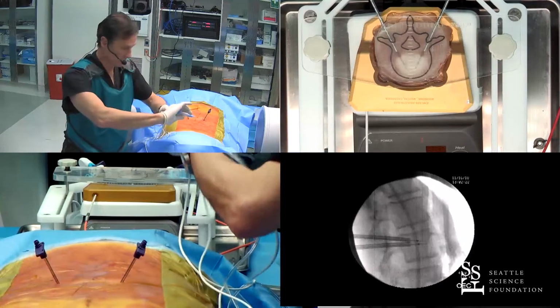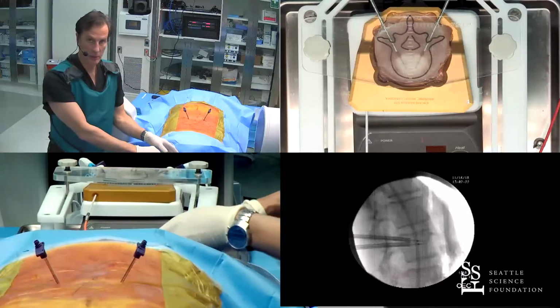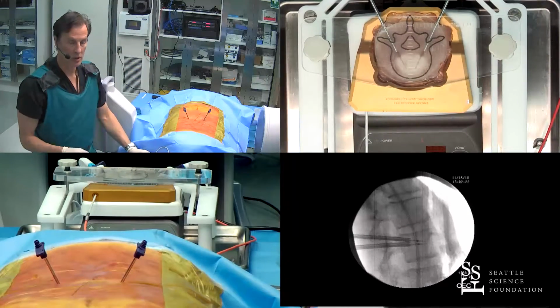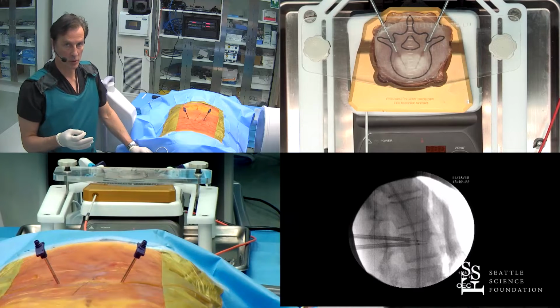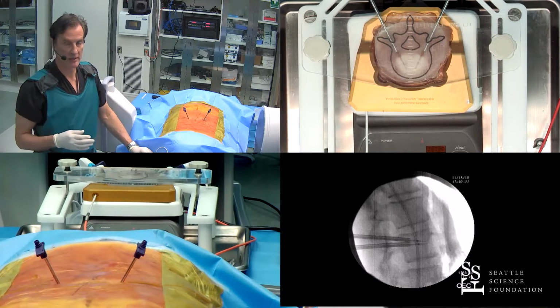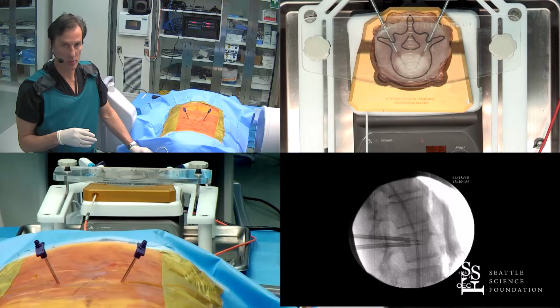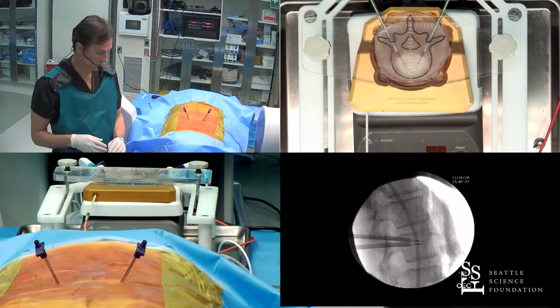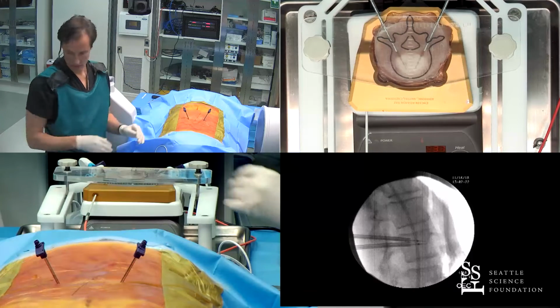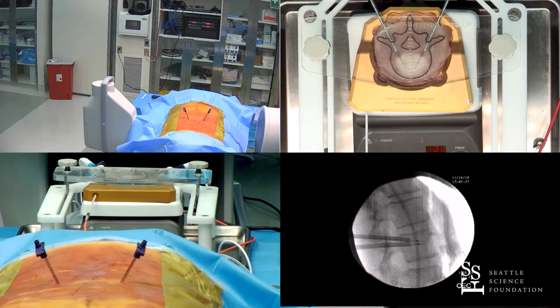You always want to ablate first because there's some evidence. Karen Murphy did a nice paper in animals that showed if you inflate the balloon or inject anything into the vertebral body, you can get tumor cells circulating throughout the vascular system. The other paper, by Cruz, showed that if you balloon prior to doing an ablation, it has the potential to spread tumor within the vertebral body. So, completed, done, and we will balloon on both sides.